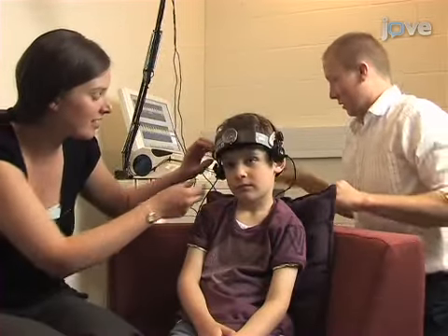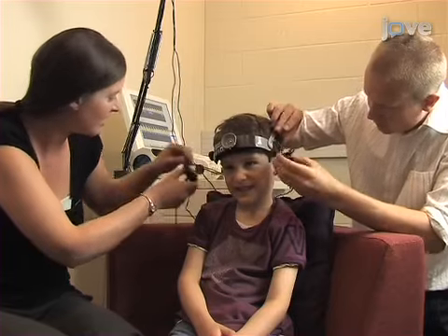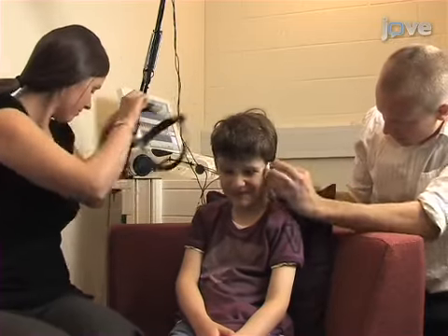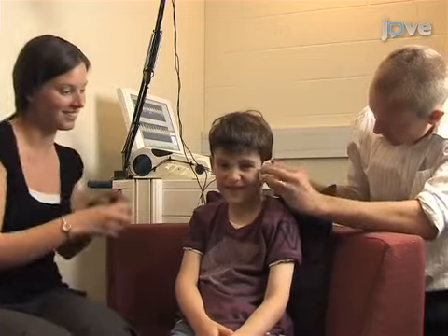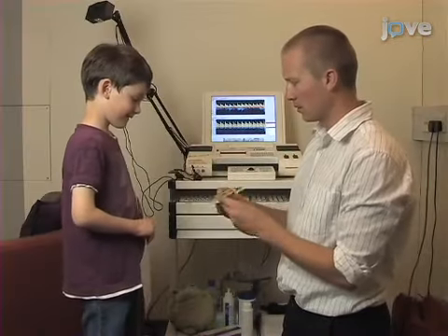When the experimental procedure is finished, stop the multi-dop recording and remove the probes. Use tissues to remove excess gel from the participant. Give the child a treat to thank them for taking part.